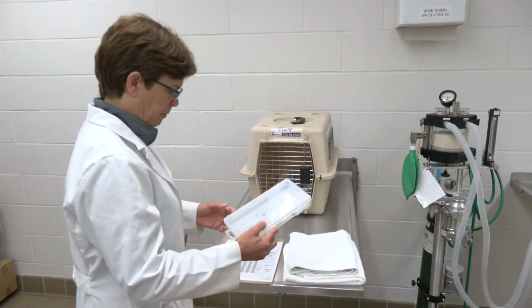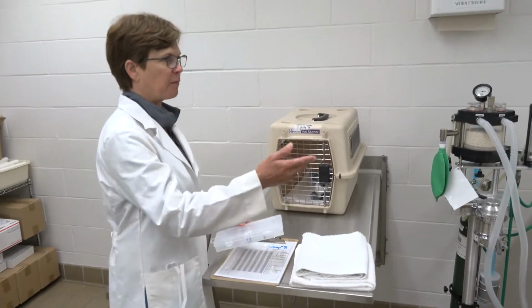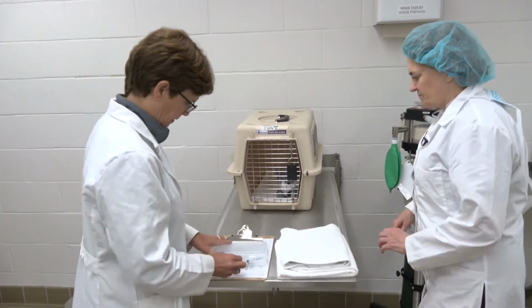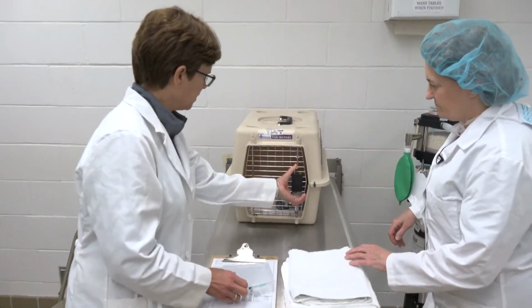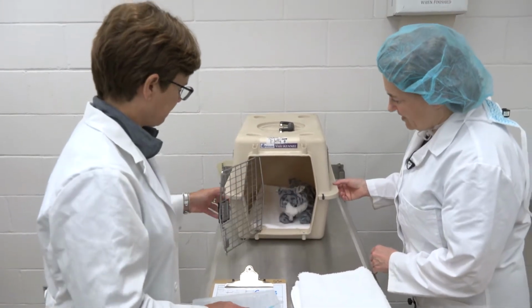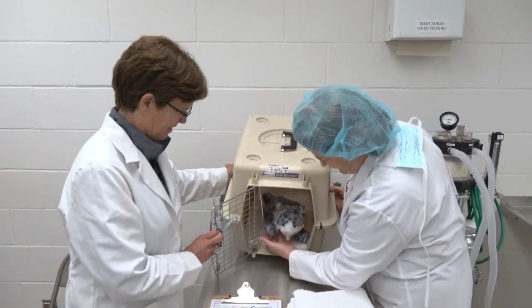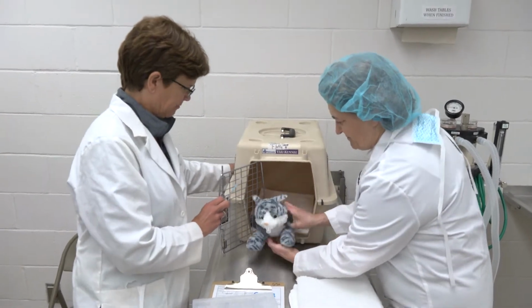So I've got my med box with my pre-med. I'm going to have my partner, Dr. Spence, come and help restrain the cat. So we'll take it out of the kennel. Hey, kitty, kitty. Hey, kitty. Oh, look, she's coming right out. This is Fluffy. Fluffy, it's a big day for you.